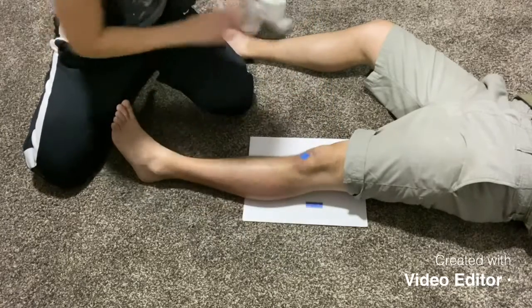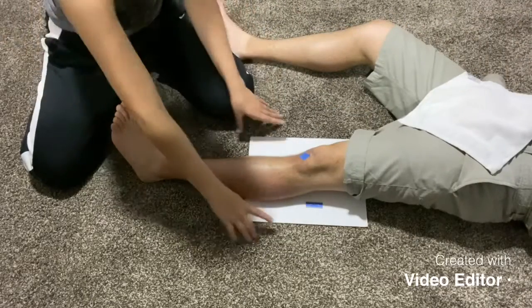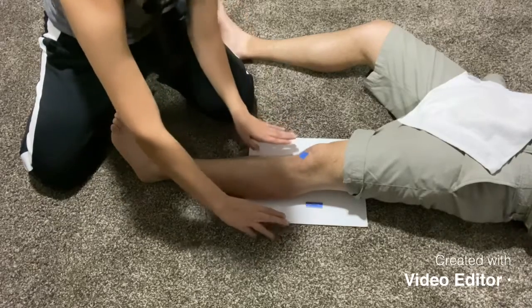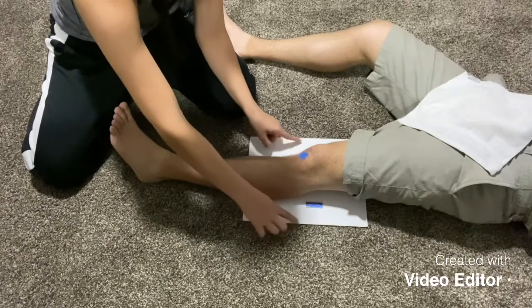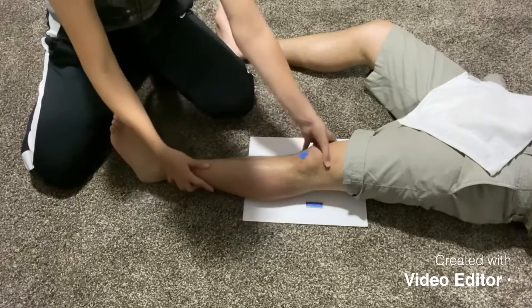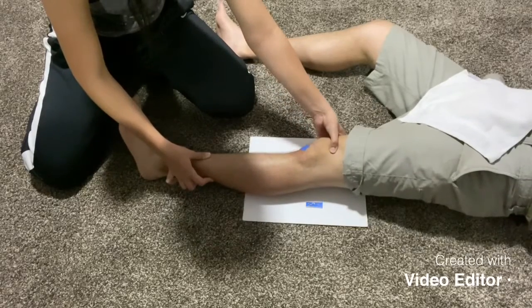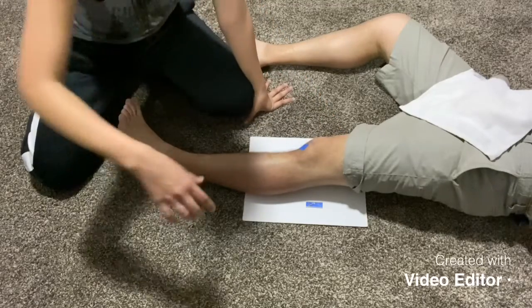Marking for the left side, shielding the gonads. And our collimation is going to be again the same as the AP knee. It's going to be brought out to 8 by 10 inches and then brought in on the sides to 1 inch on either side. Should you stay rotated? All right, and click for our medial oblique.